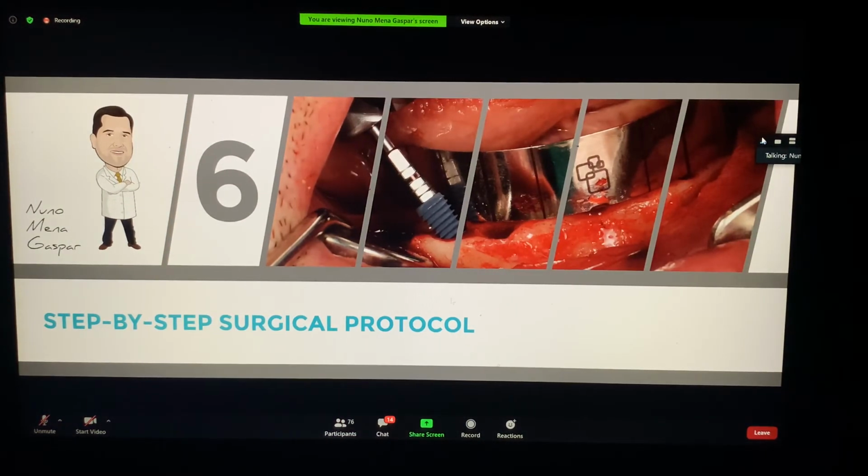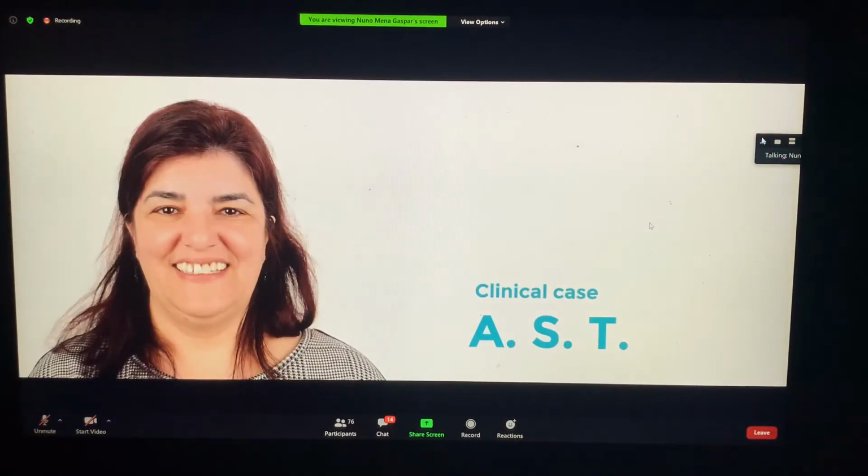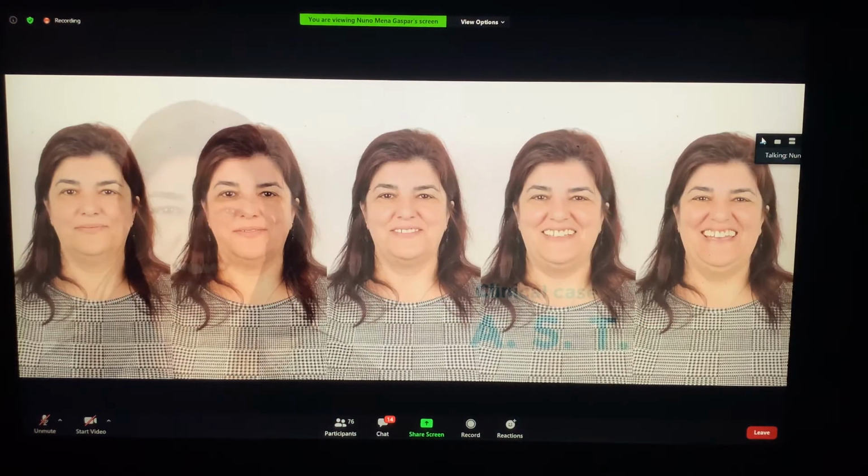Okay, so AnyRidge. This lady had to do an upper full arch case.